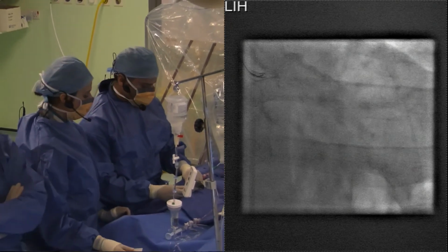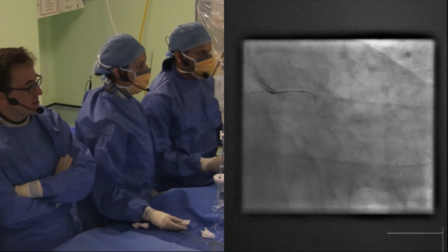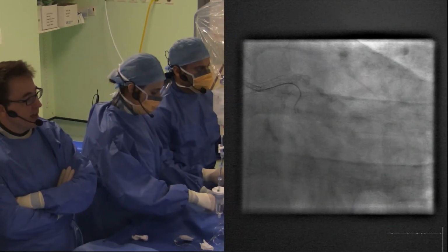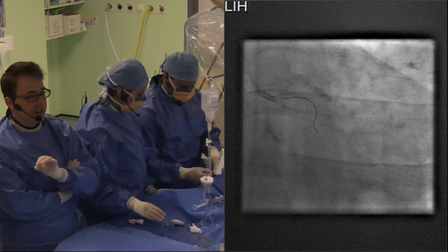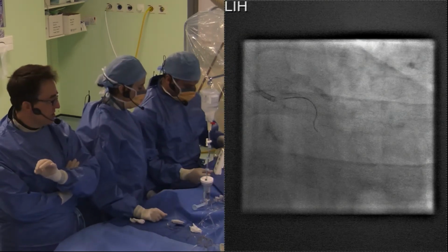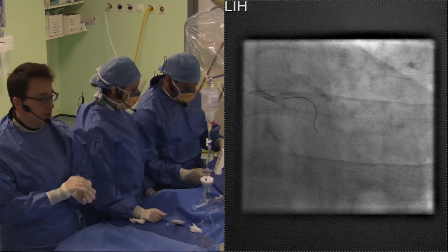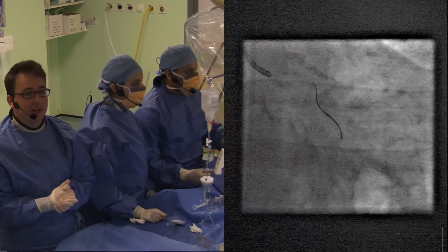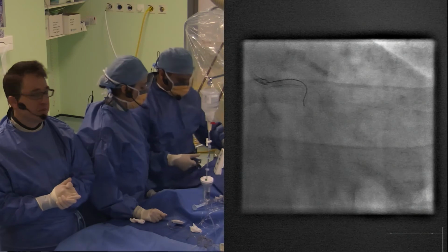Perfect timing. So Dr. Sen has got the wire up, so you can just see the tip is going into the circumflex artery now, and he's done that very elegantly. And so we're going to just pause there with the wire just at the ostium of the guiding catheter. And the next thing I'm going to do is, once Dr. Sen has removed the introducer needle, and you can see we always do this routinely, is to remove the introducer needle. And indeed, we'll even do this for the pullback, and I'll show you how we do that in a second. We put the wire just perfectly positioned at the ostium.